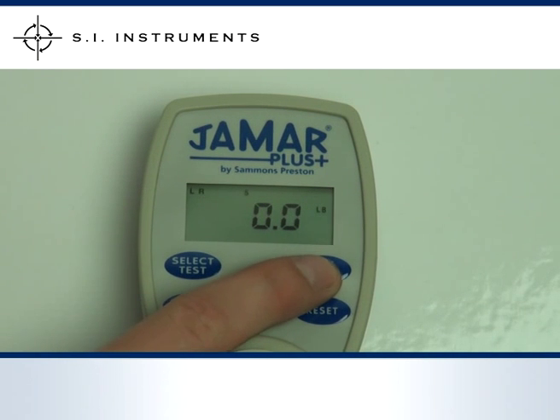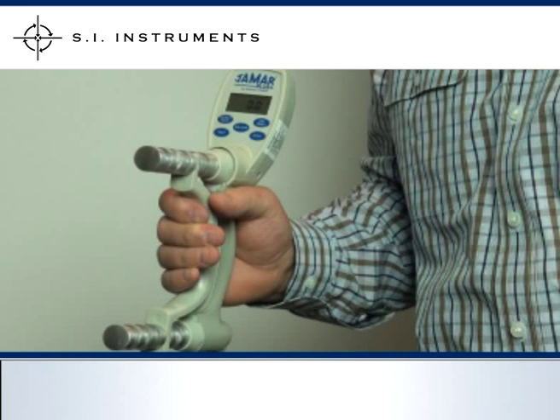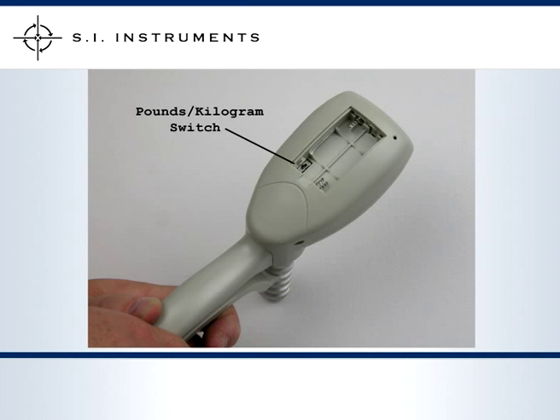Like the J-Mart Hydraulic Dynamometer, the J-Mart Plus also features an adjustable handle. The handle itself acts as a position lock which can be easily snapped on and off of the J-Mart Plus. Ensure that the locking end is always at the bottom of the unit.